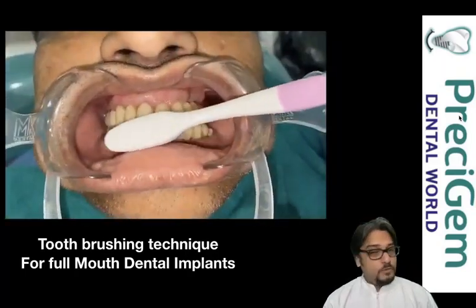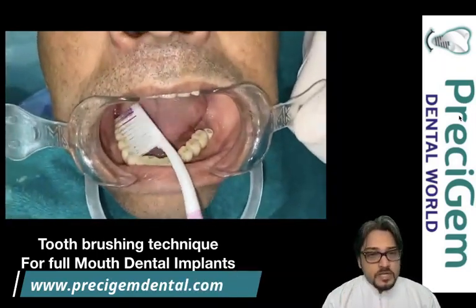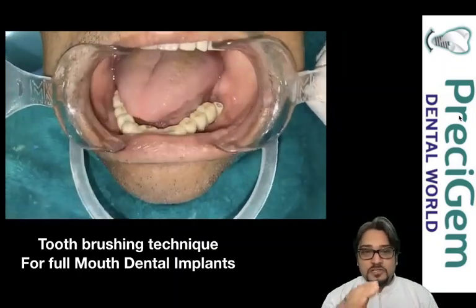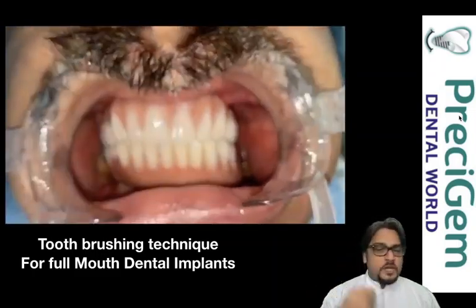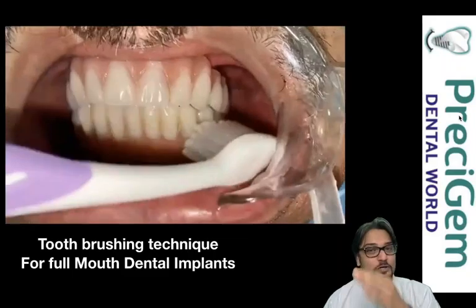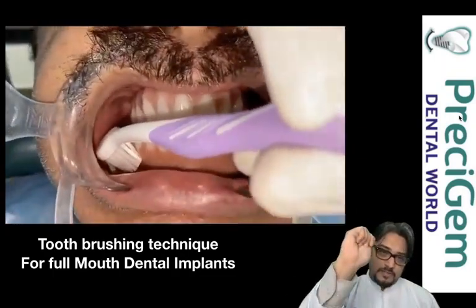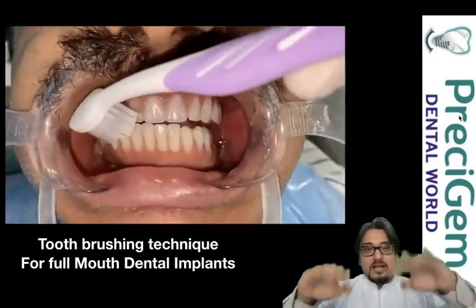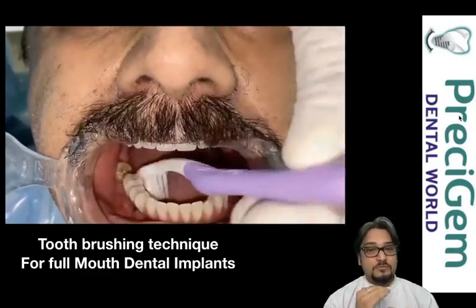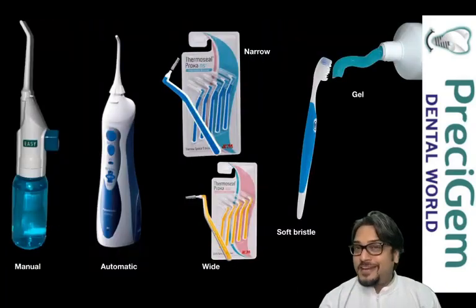Shall we do just one of these techniques? I would suggest all three are important — tooth brushing and oral irrigation are the most important, and interdental brushes are important when significant spaces are present. Now let me show you the same tooth brushing technique on FP3 prosthesis. You can use a circular motion initially to clean the tooth surface, but you must also clean the tooth-gum junction. Target the toothbrush at 45 degrees, swipe front and back, then move up. This removes plaque at the tooth-gum junction and improves oral hygiene.